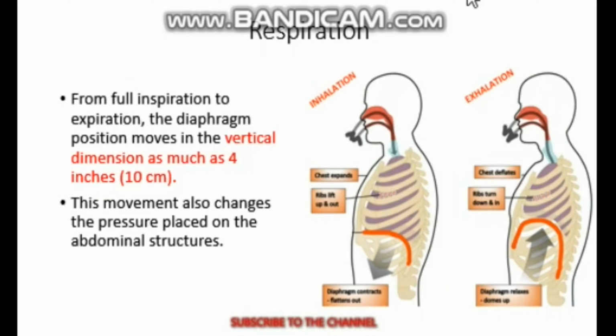Respiration is the process of getting oxygen into the body and releasing carbon dioxide. We do cases that require inhalation and exhalation. For instance, chest X-ray, we do it by full inhalation. Some cases in chest X-ray, we do it by full exhalation. Example, pneumothorax, air trapping, foreign body, and others.